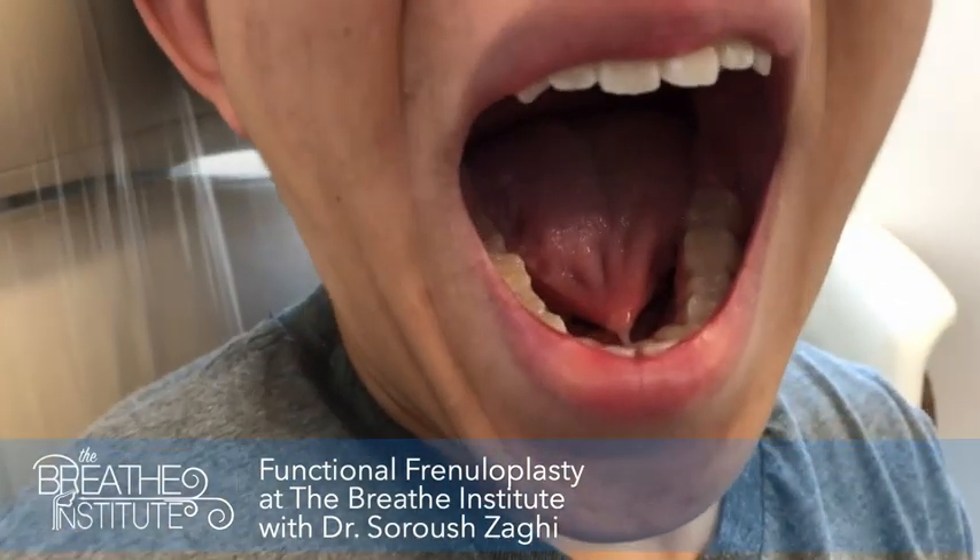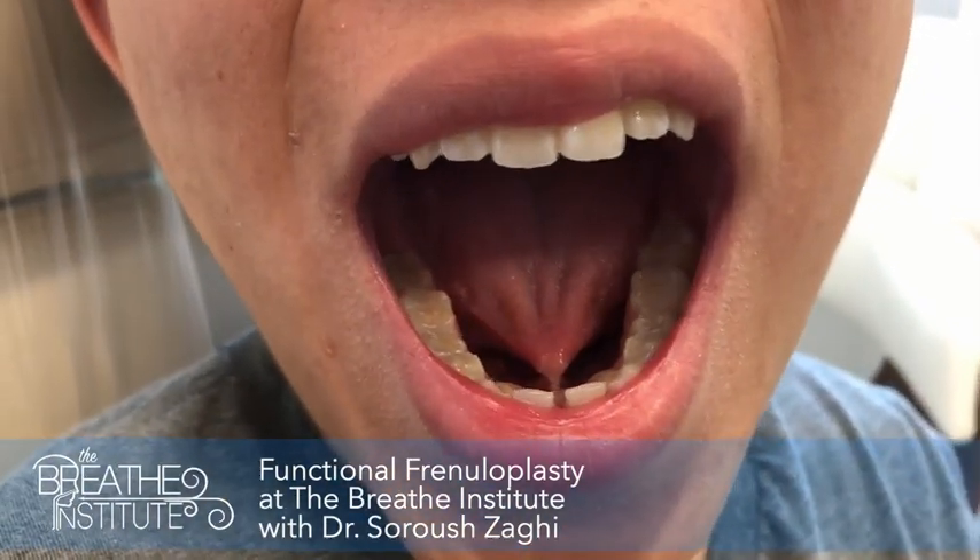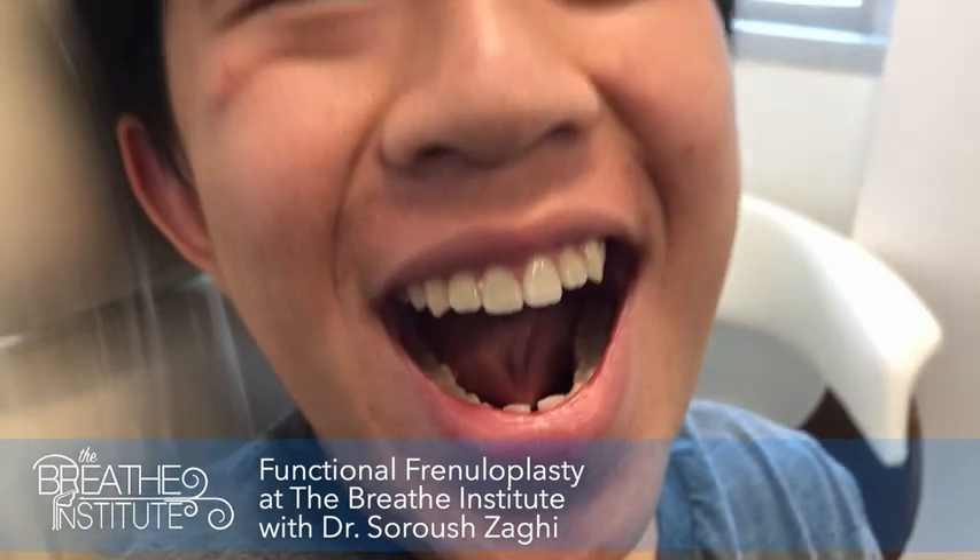Welcome. Thanks so much for coming to see us. You're here to see us for a tongue tie, is that right? Yeah. Go ahead and just open your mouth for me. Good. And try to lift up your tongue the best that you can. So we talked about the fact that your tongue tie is contributing to your speech, is that right? Yeah.